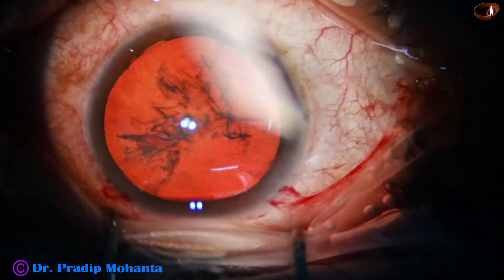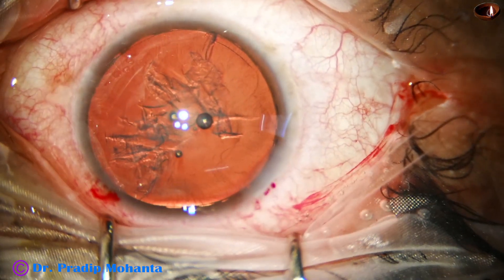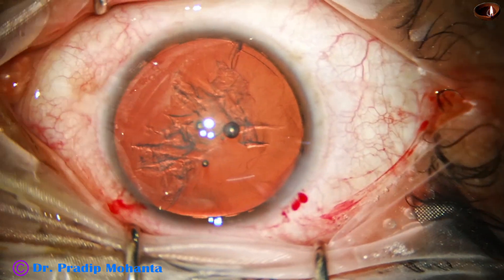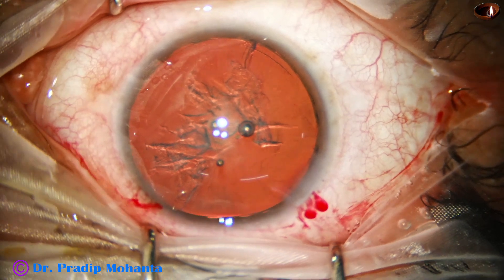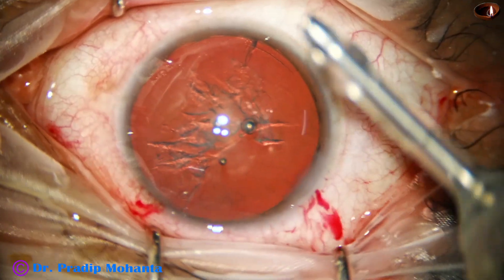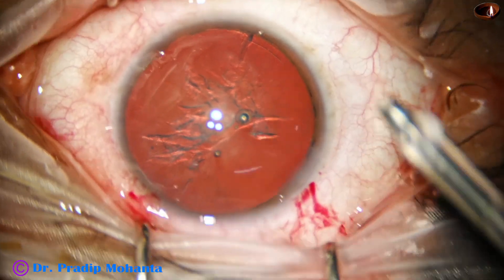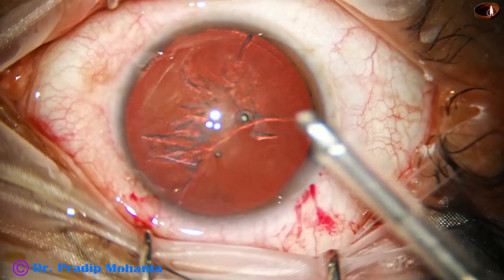So I am going to use my friend Dr. Neto Rosatelli's ball-tipped chopper in this case. It is a long chopper with a ball-tip round body. From the bend, the length is 2.25 millimeters.